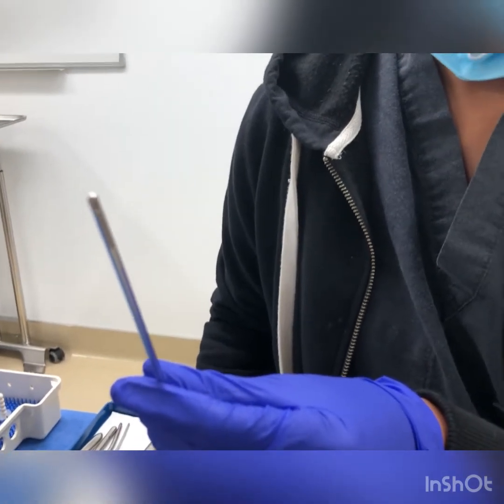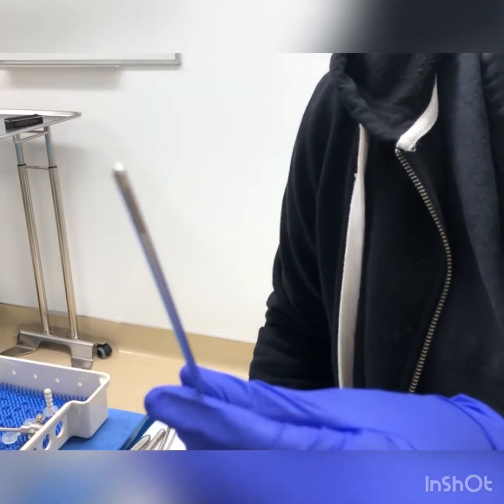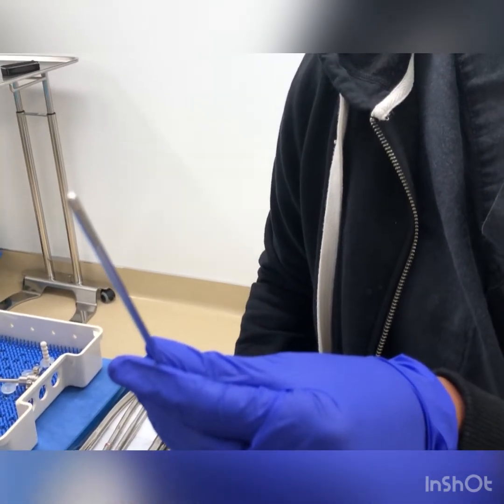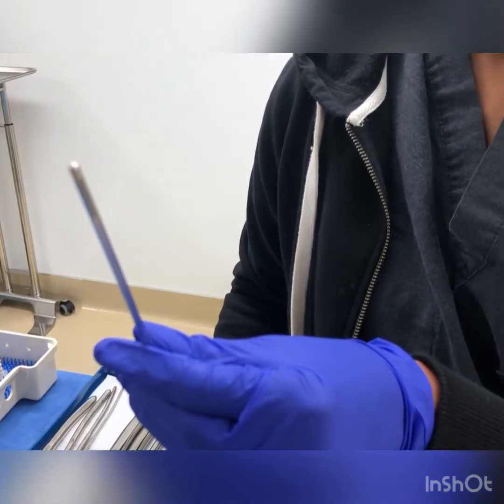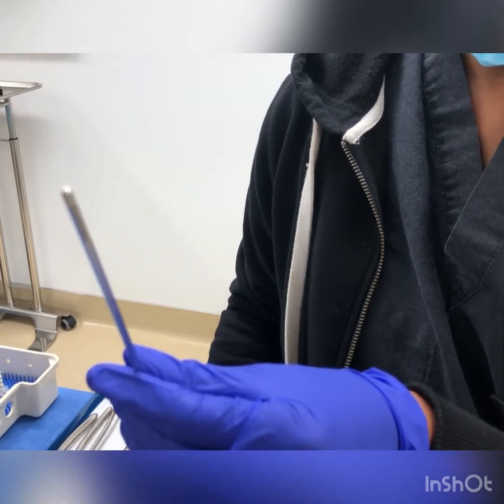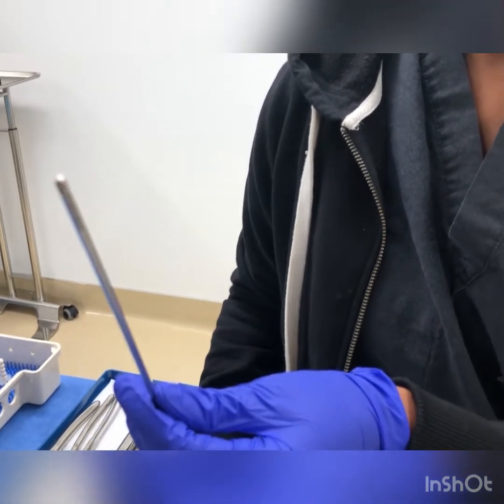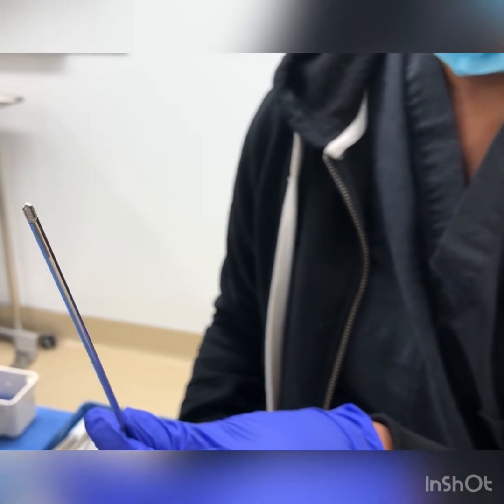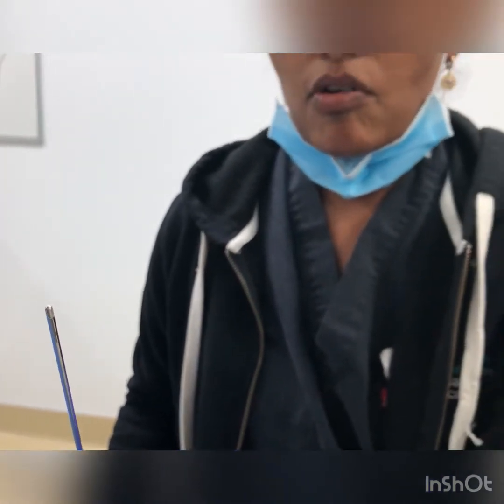You may be able to see the oscillation of this tip. Sometimes this takes 1 or 2 minutes if it's a very small and fleshy polyp, and if it's a tough fibroid, it can take upwards of 20-30 minutes. But overall, this is a very quick procedure.